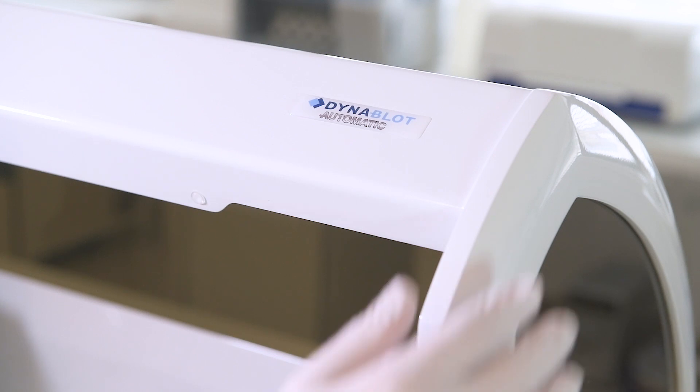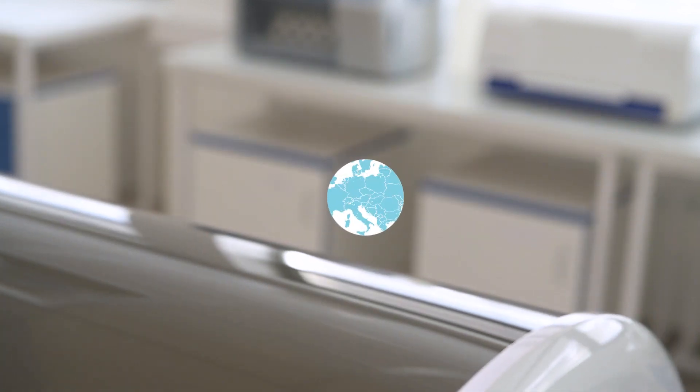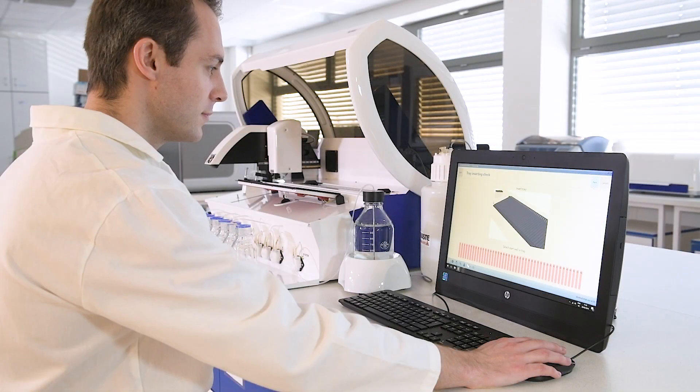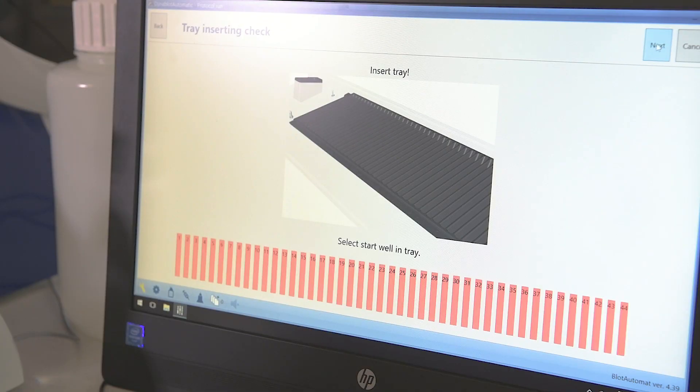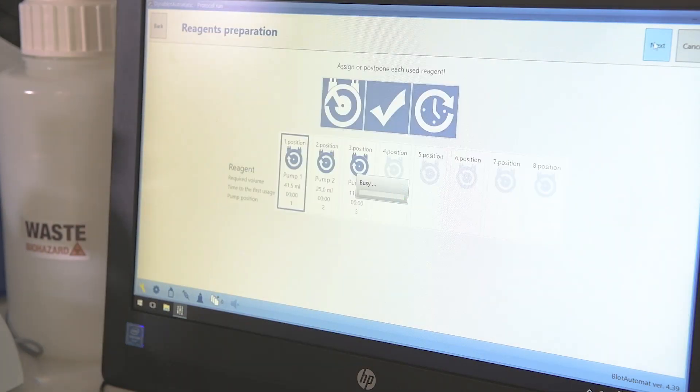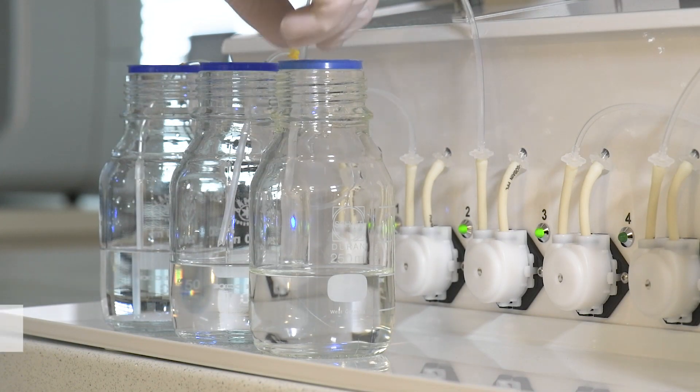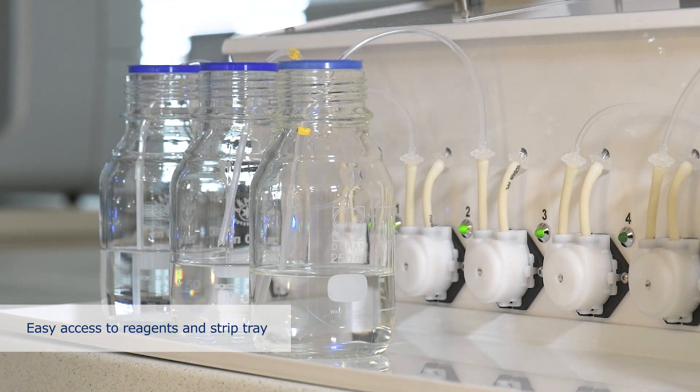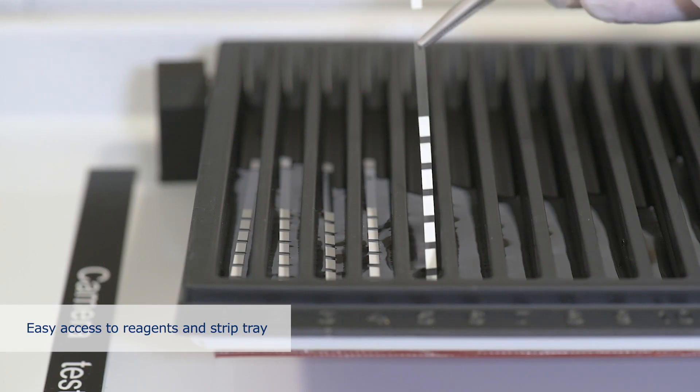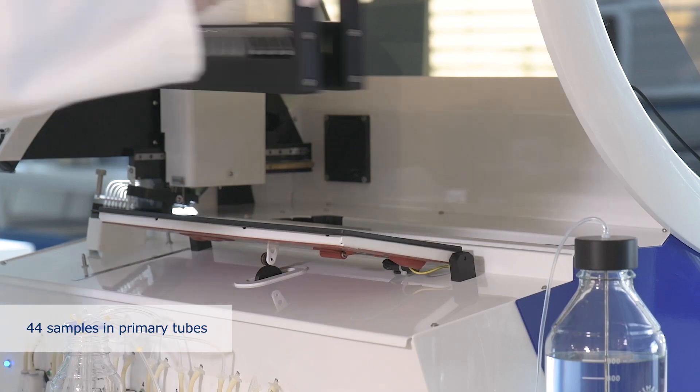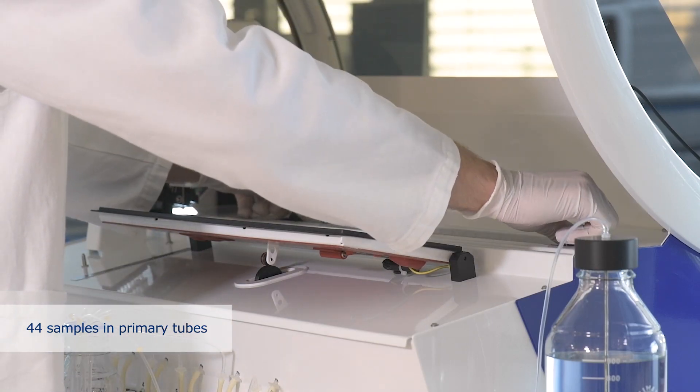The European origin and our passion assure the highest quality and reliability. The intuitive software guides the user through the short priming and loading procedure. When designing DynaBlot Automatic, we've put great emphasis on easy accessibility of the reagent bottles and strip tray. The sample rack is removable and allows a comfortable way of loading in primary tubes.